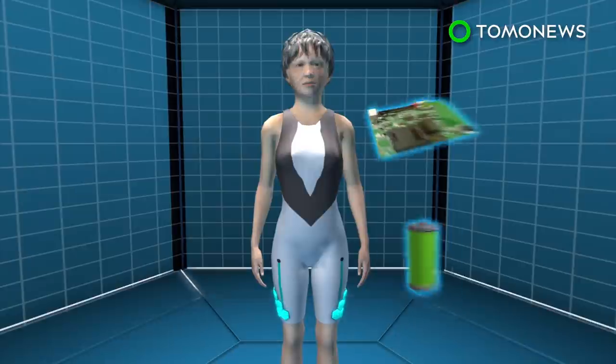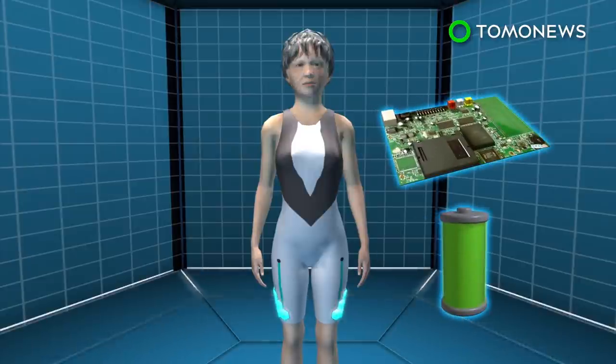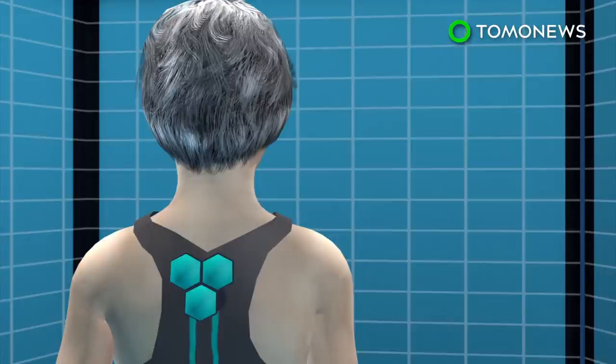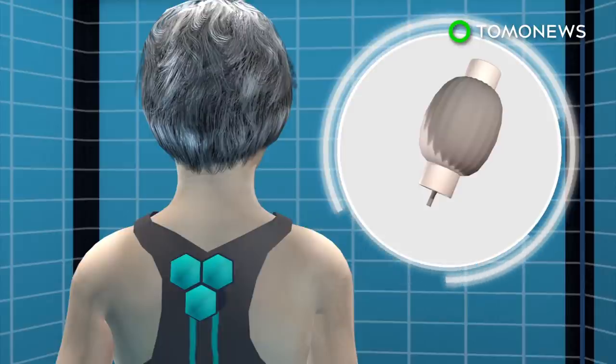The hexagonal pods placed around muscle groups contain batteries, control boards, and elastic muscle technology. The technology contains a smart material that behaves like human muscle, which expands when exposed to an electric current and contracts when the current is removed.